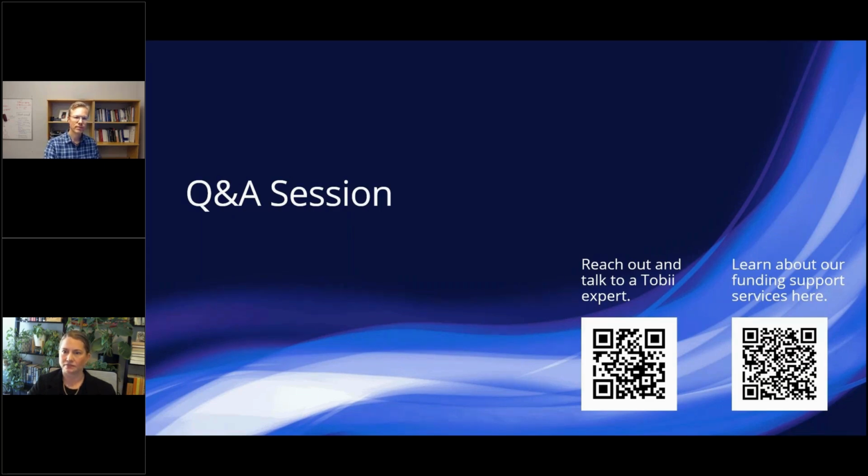I find eye openness can also be helpful to detect if people are especially focusing, confused, or even straining to read, as squinting can be common in these situations. Perhaps it could be used to troubleshoot data quality issues related to eye tracking, to eyes that are too closed, squinting, or droopy lids. So yes, you can get all of that eye openness data with our systems. That was from Laurence. Hi, Laurence.